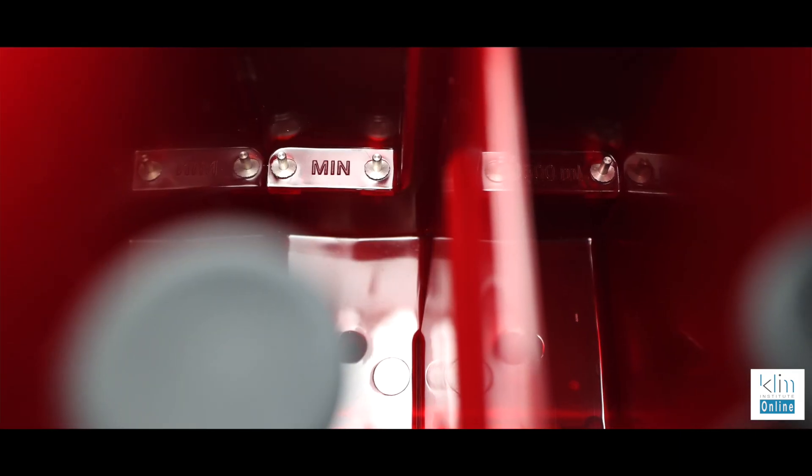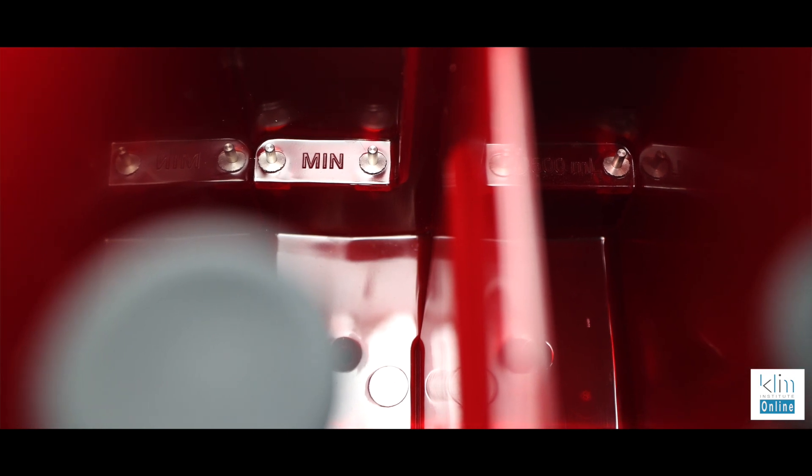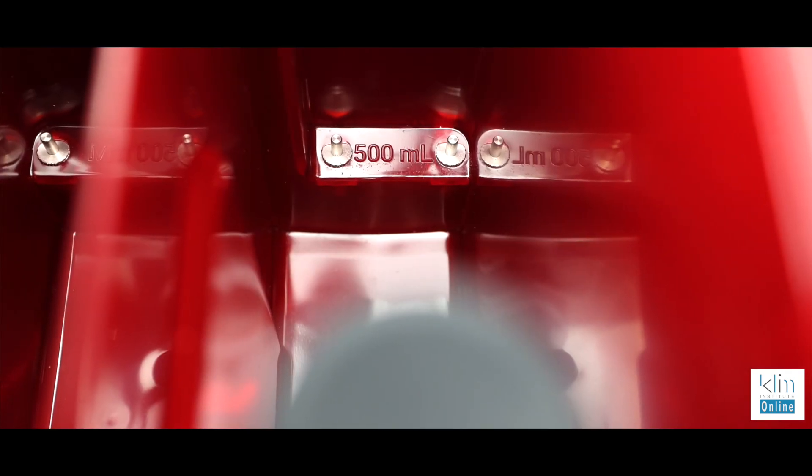Hi, how are you folks doing? Today I unpacked the SprintRay Pro Wash & Dry and I tried it for the first time — it's mind-boggling. I've been printing for years and going through the processing of models when we're done: the alcohol, the goopy resin, and the processing and cleanup.